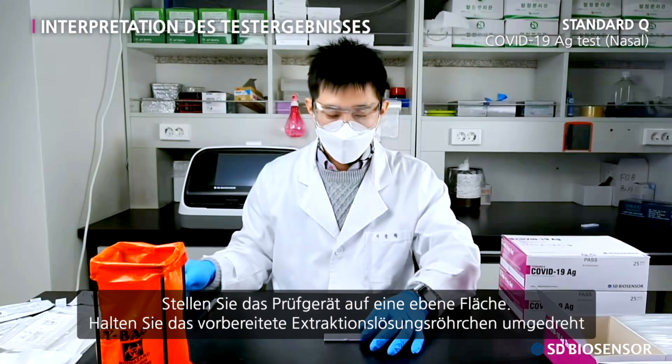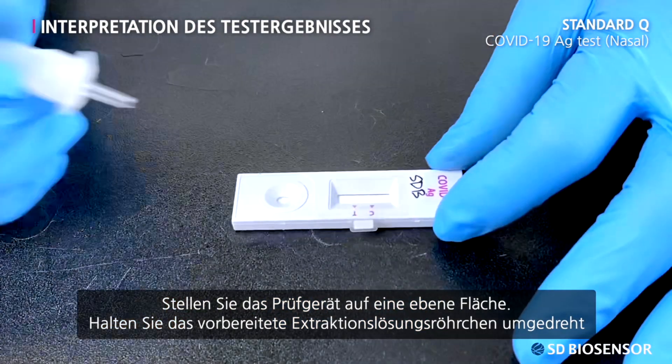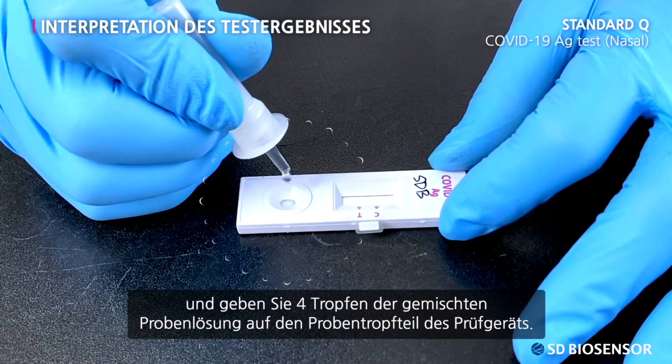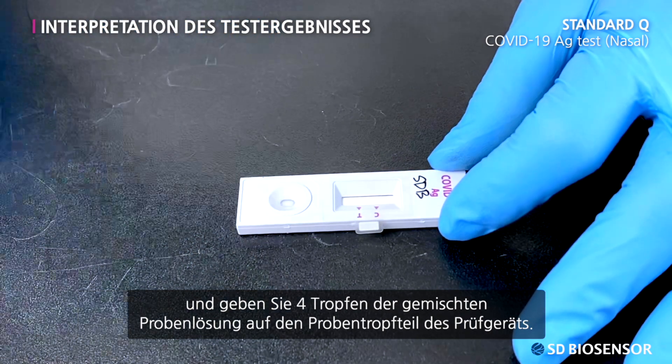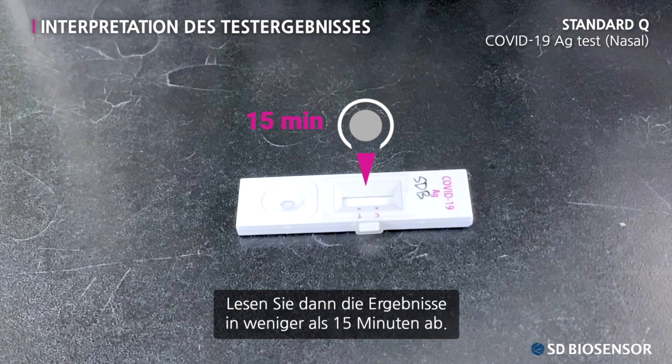Place the test device on an even surface. Hold the prepared extraction buffer tube upside down and apply four drops of extraction buffer to the specimen well. Then read the results within 15 minutes.